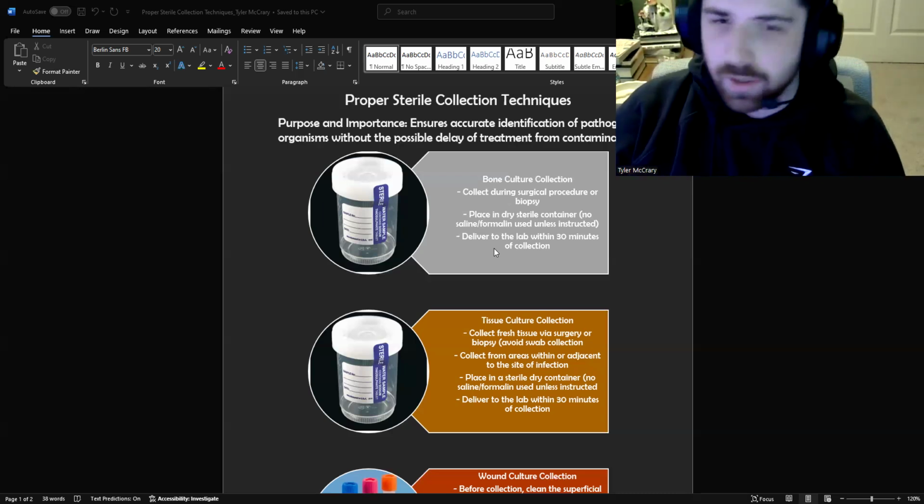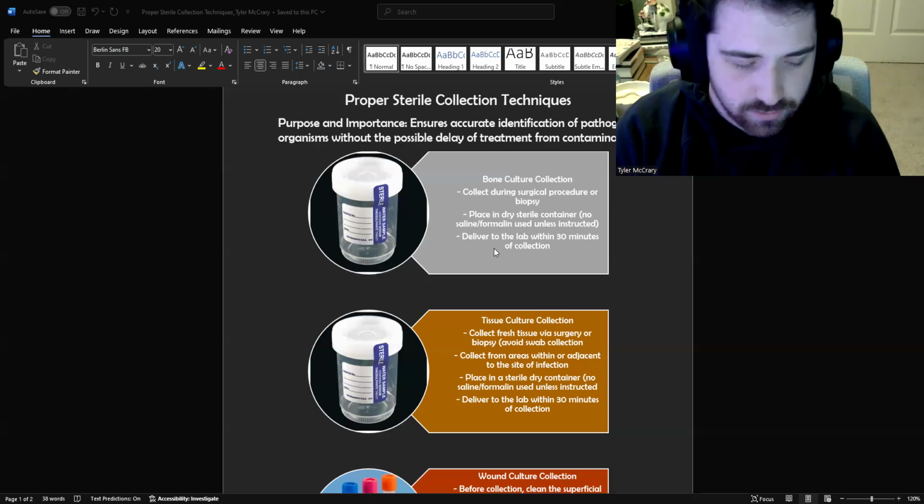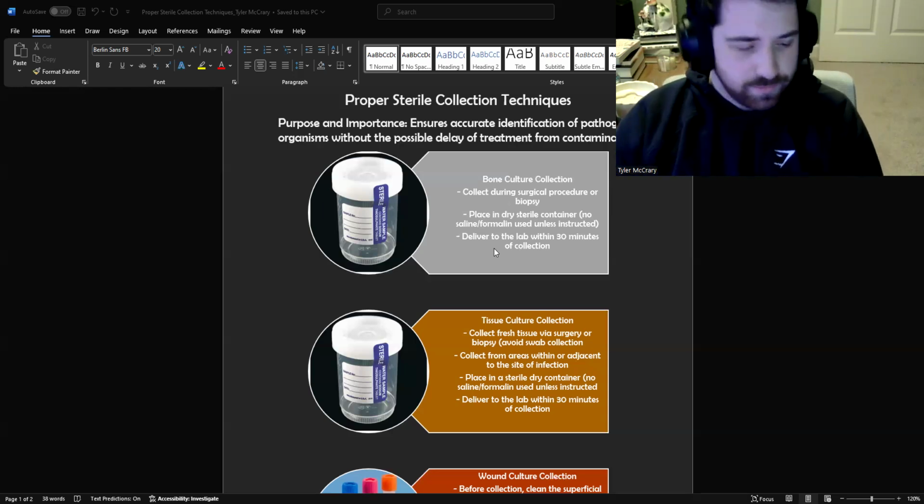For both bone and tissue cultures, it is best to be delivered to the lab within 30 minutes. That way it's fresh and there are no other sources of contamination.